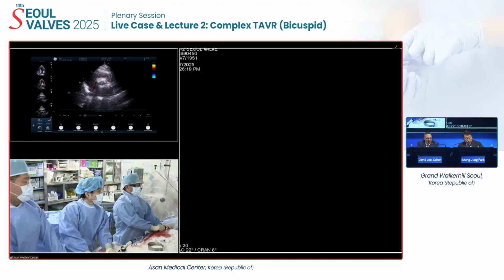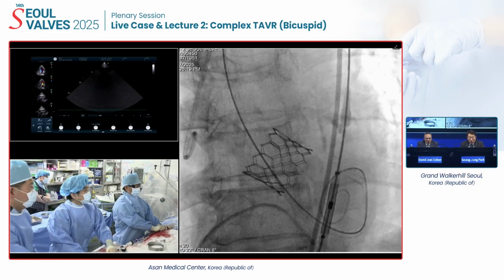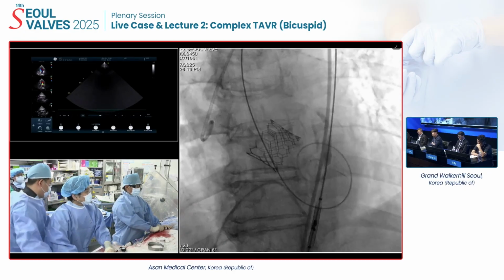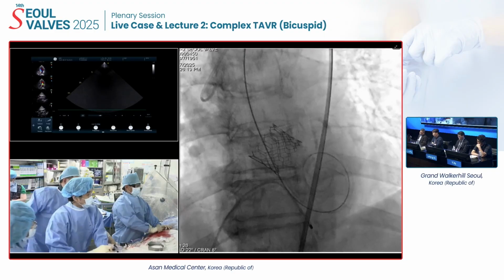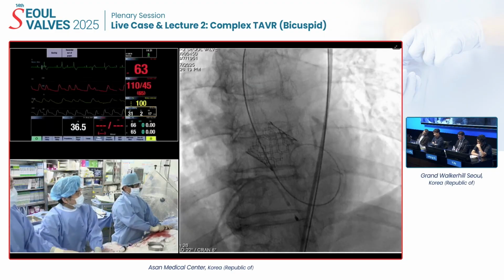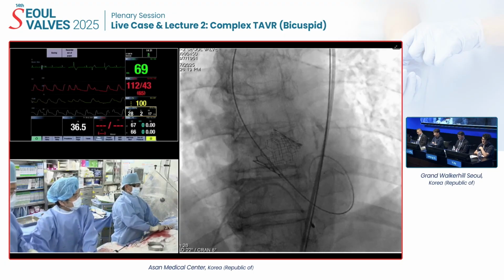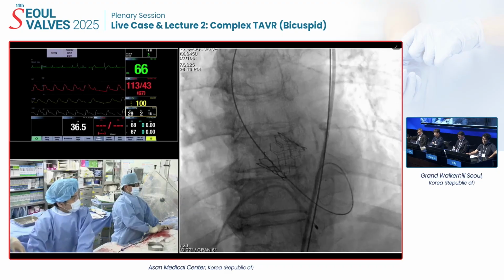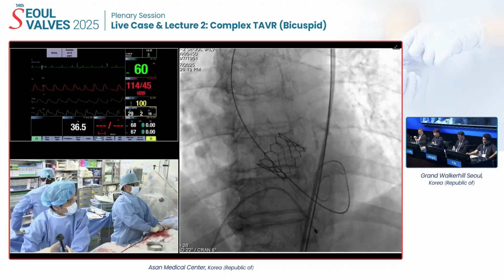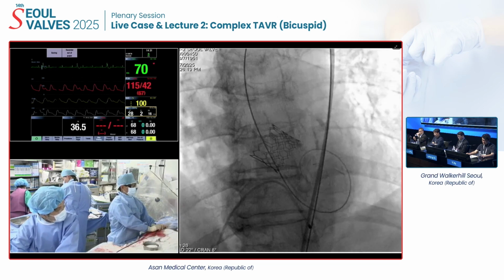Okay, I'd like to remove the device. Wire please. And then change it to the pigtail.